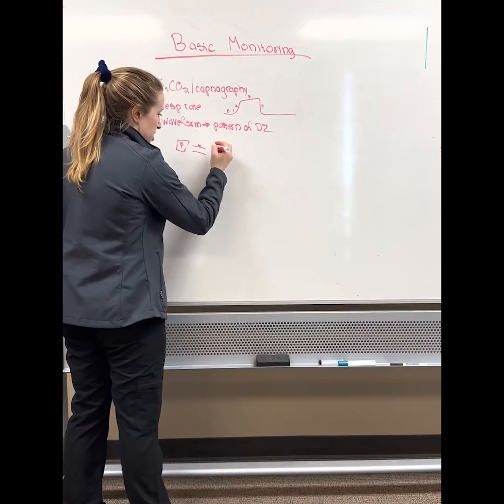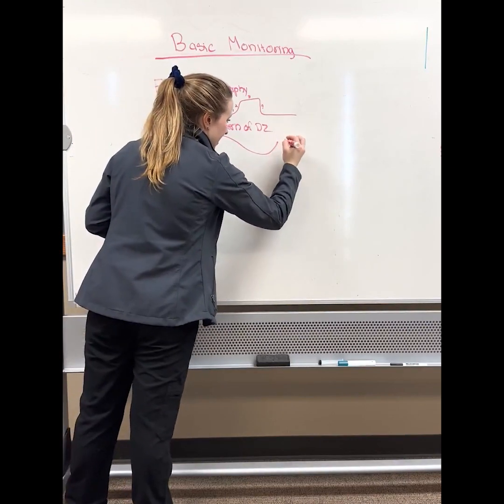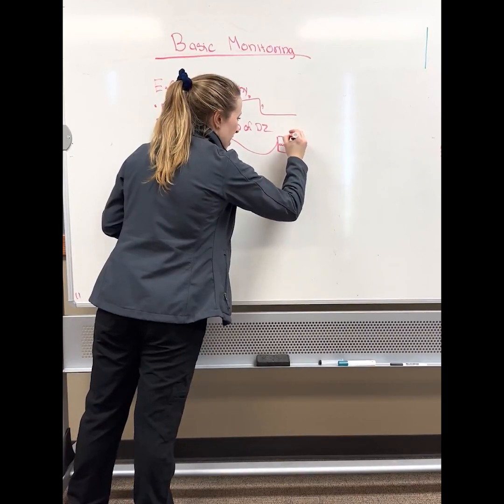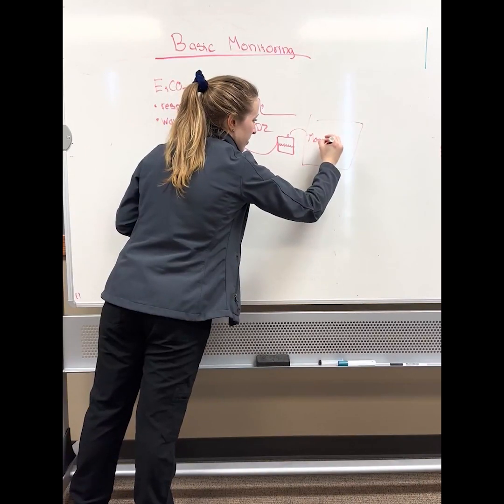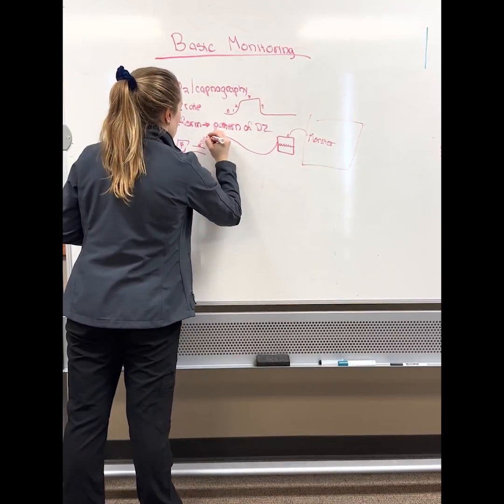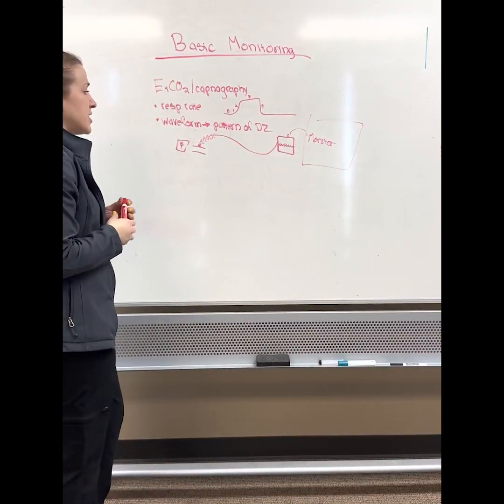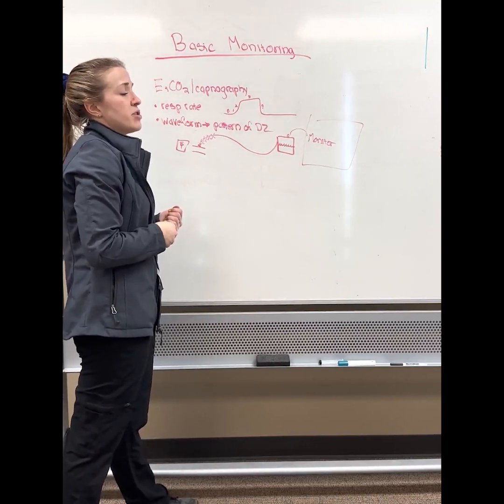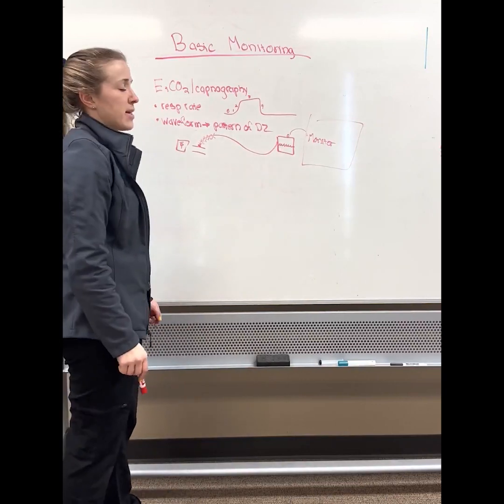It's got kind of like a tunnel, and then it's got either a screw-on port or a line, and then it goes up to some type of monitor, which usually has a water trap, and then there's a sensor, and then this goes to a big screen monitor. And usually somewhere on the tubing, there's going to be a crosshatch waffle weave pattern, and that is called Nafion tubing. The idea behind the Nafion tubing is that it prevents some of the risk of condensation from developing inside of the line and traveling up here to the monitor where it can damage it.